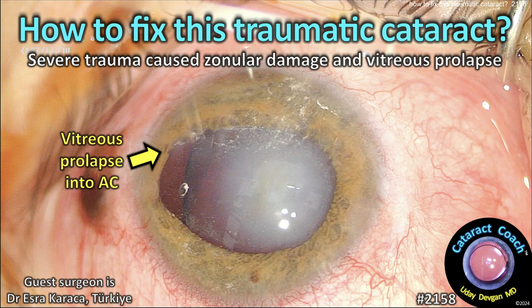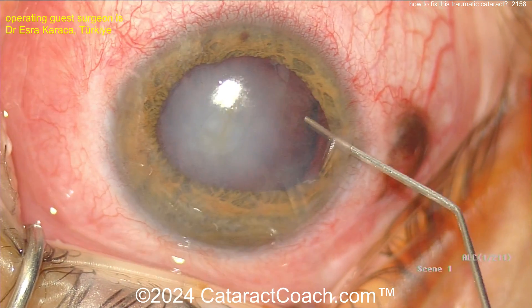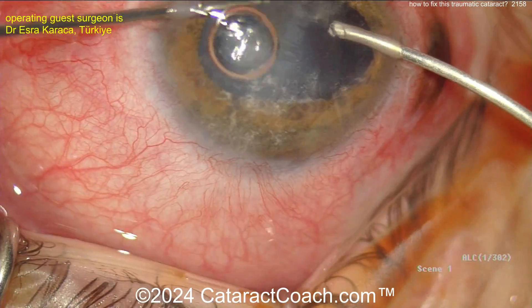CataractCoach.com. How to fix this traumatic cataract. Severe trauma causes zonular damage and vitreous prolapse. Now you can see there is a big gap there. We see the lens capsular bag equator, and then the gap is because the vitreous is coming through that into the anterior chamber.